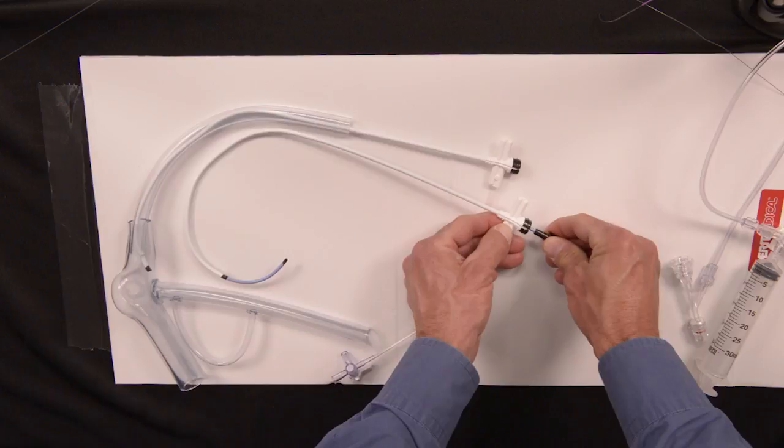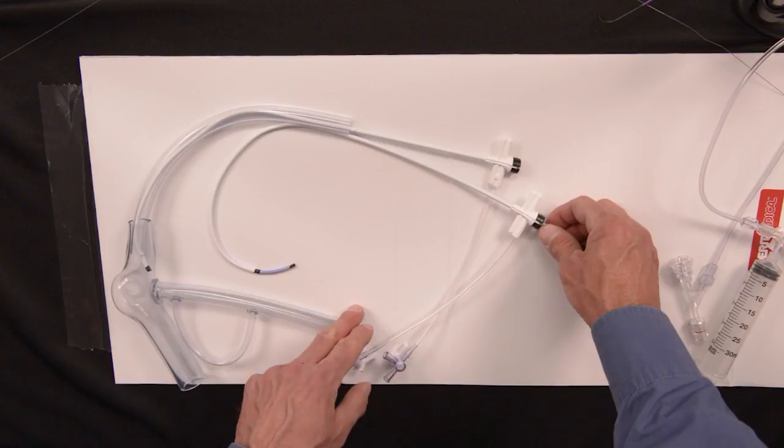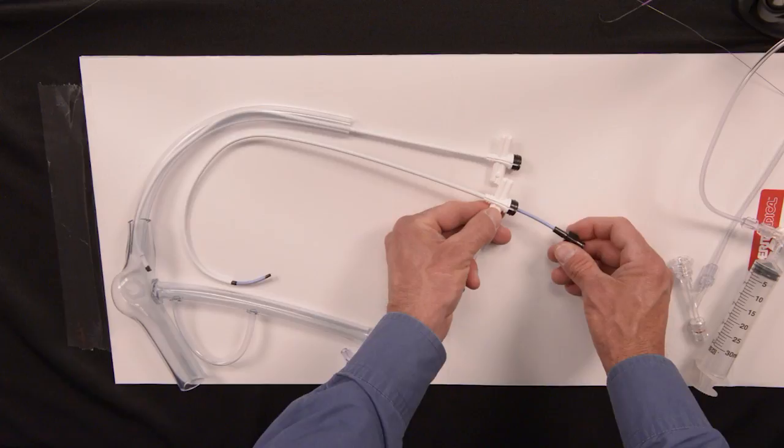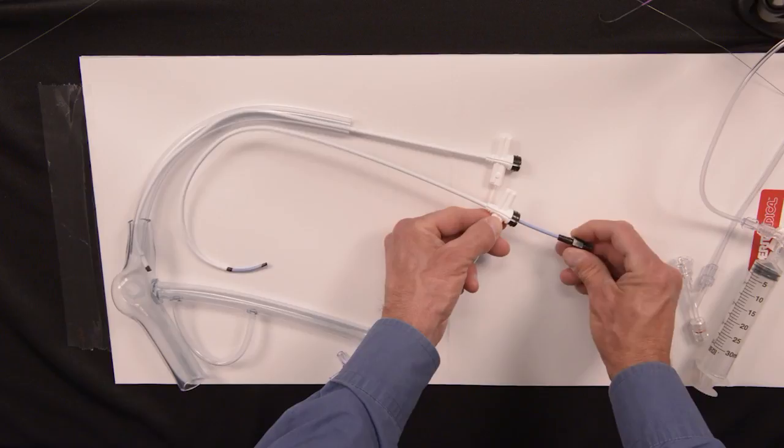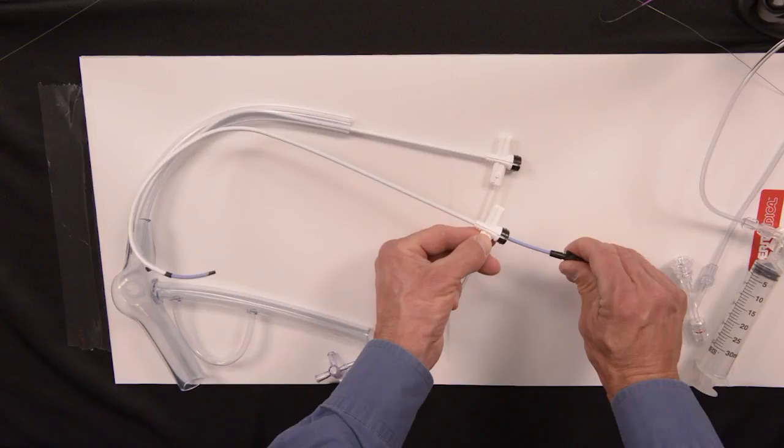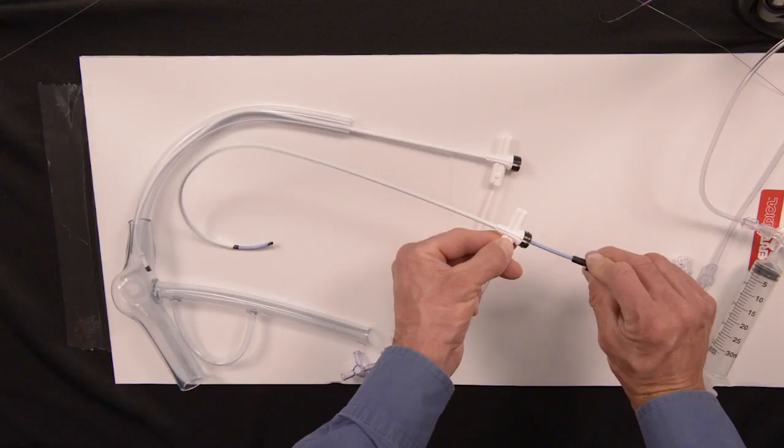The coronary sinus is a posterior vessel and goes backwards, so typically we're going to be using counterclockwise torque to cannulate once we get the braided core into the right atrium. As I turn this with my fingers counterclockwise it goes posterior; if I go clockwise it rotates to the anterior where we're typically not going.